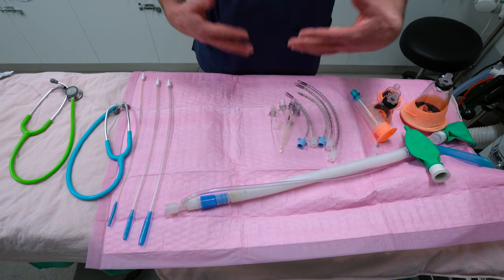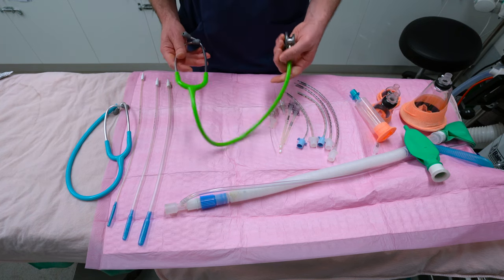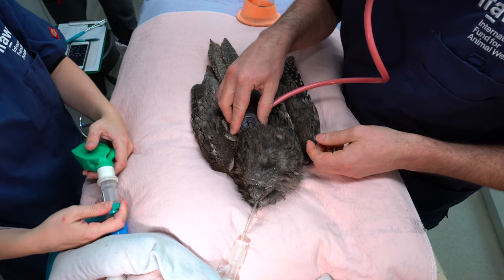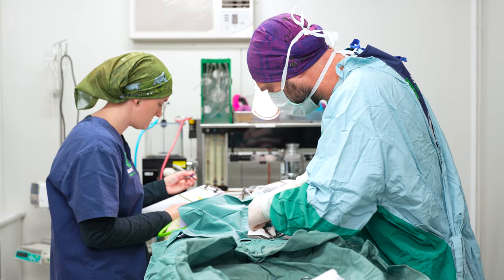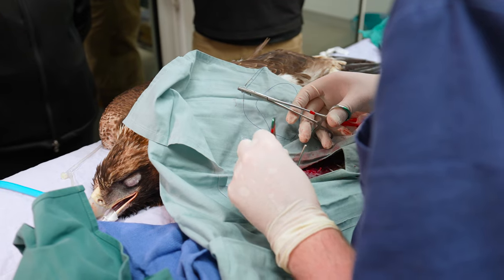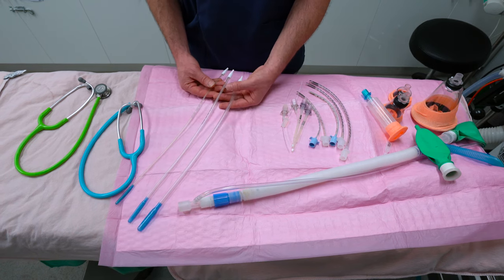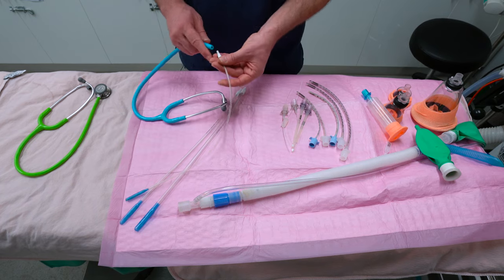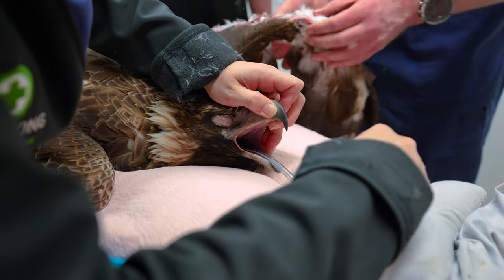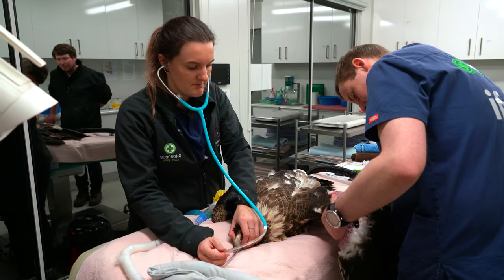In terms of monitoring the anesthesia, one of the most important pieces of equipment is still the stethoscope, just to check the heart rate constantly. If the animal is under drapes during surgery and we cannot use a normal stethoscope, we use esophageal stethoscopes — connected to a normal stethoscope piece and introduced into the esophagus — positioning them where the heart sounds are clearest.